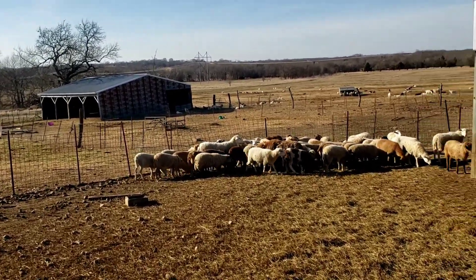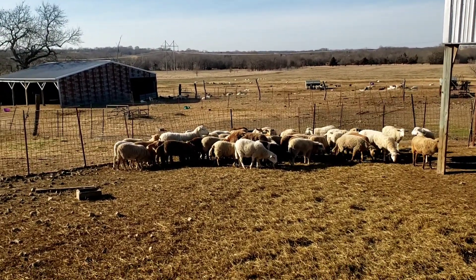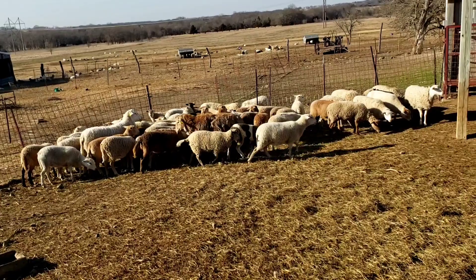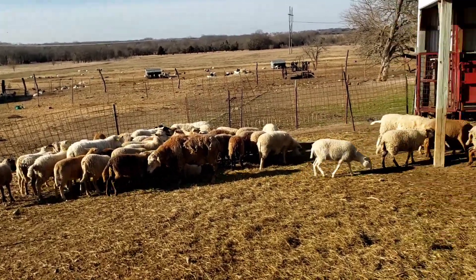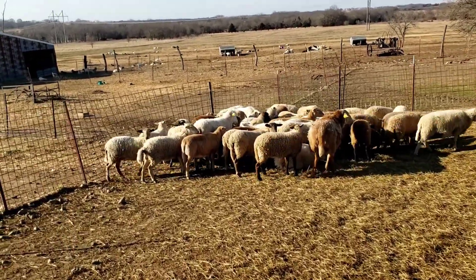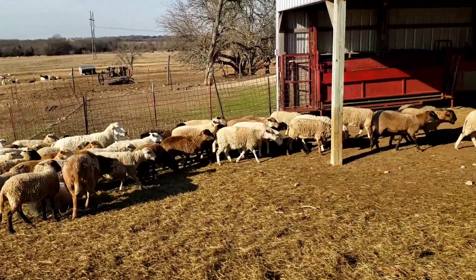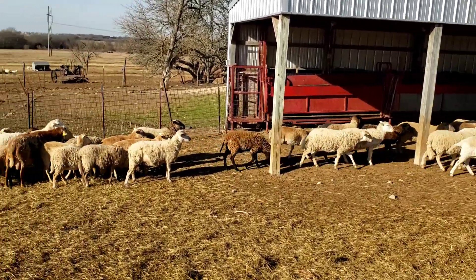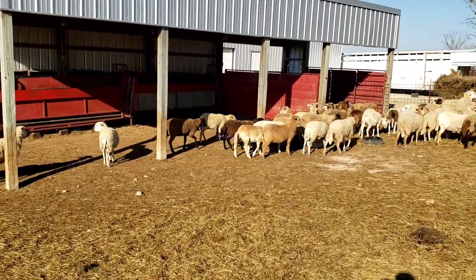We got done sonogramming all the ewe lambs. Wyatt got here about noon yesterday, we probably didn't get started till two o'clock, did some yesterday and finished them up today. This group here are ewe lambs that didn't breed the first time. It turned out there was maybe less than 11 percent that didn't breed - that's not too bad. I remember when I first bought ewe lambs from Hopping Brothers that didn't breed the first time.